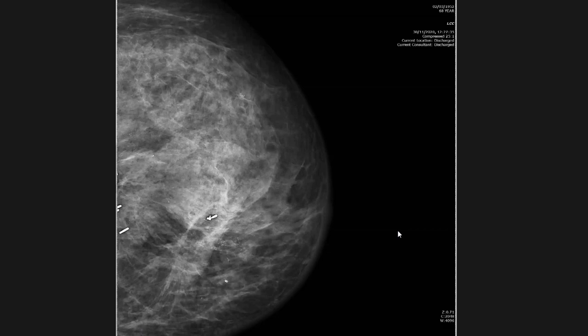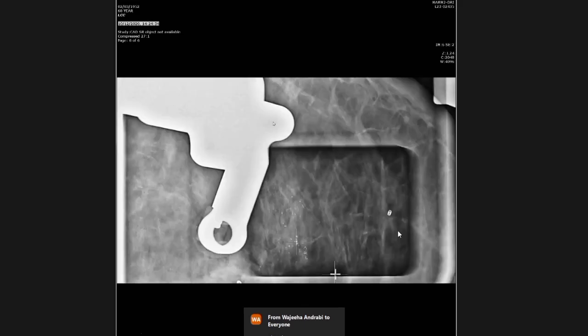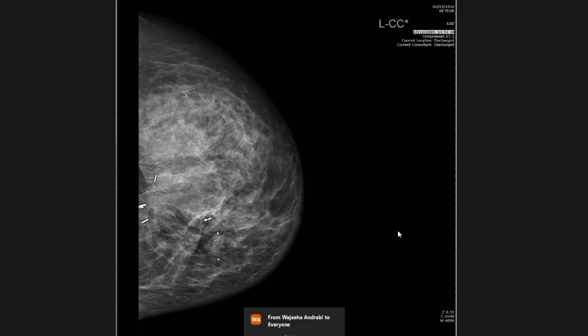Okay. And what we normally do is a stereo biopsy. So we localize it with the mammogram machine, and we do a stereo vacuum-assisted biopsy. Remove a large volume of the tissue, and then we X-ray the specimen to make sure we've obtained enough calcification, and we put a marker in the area where we've taken the calcification, just to confirm we've got the correct site.